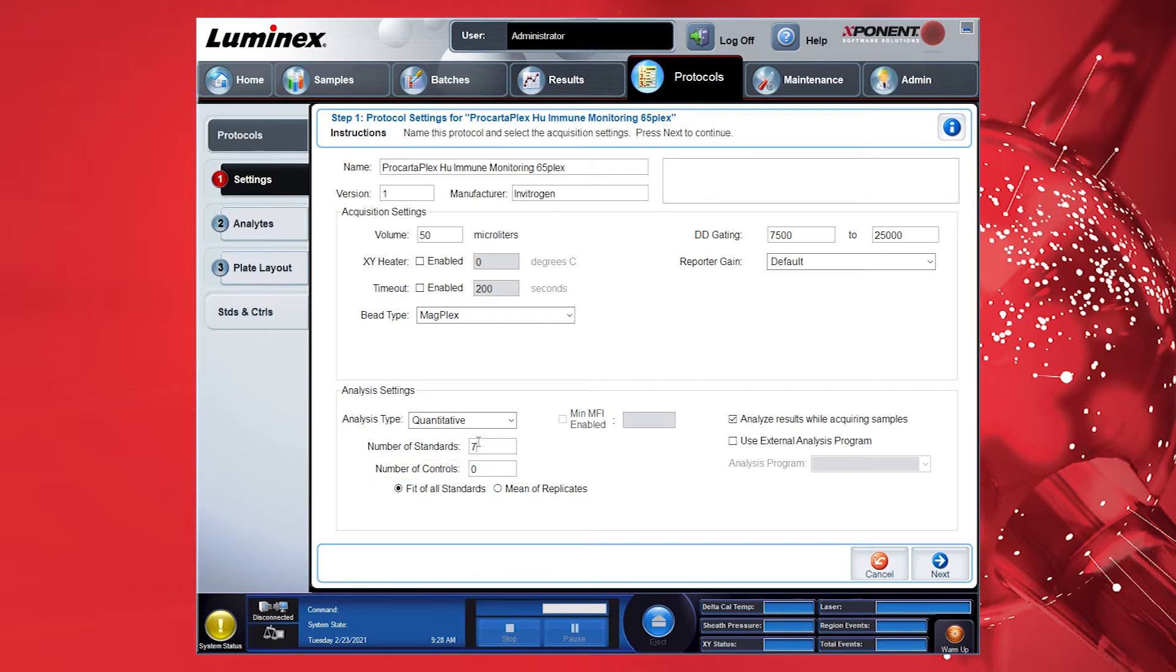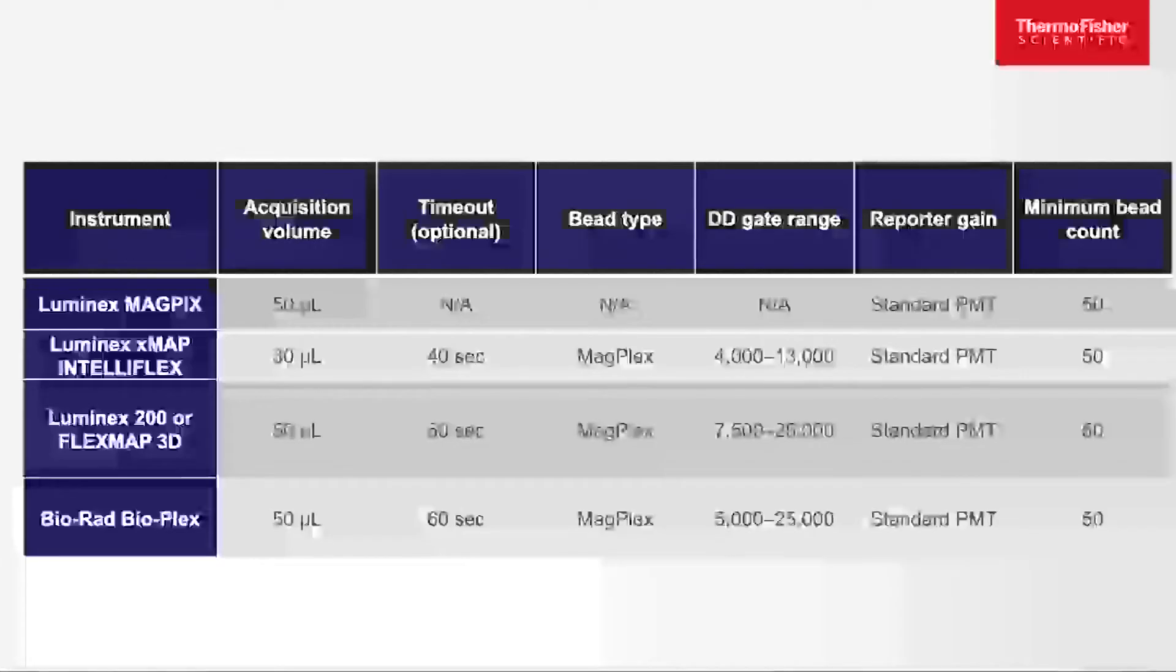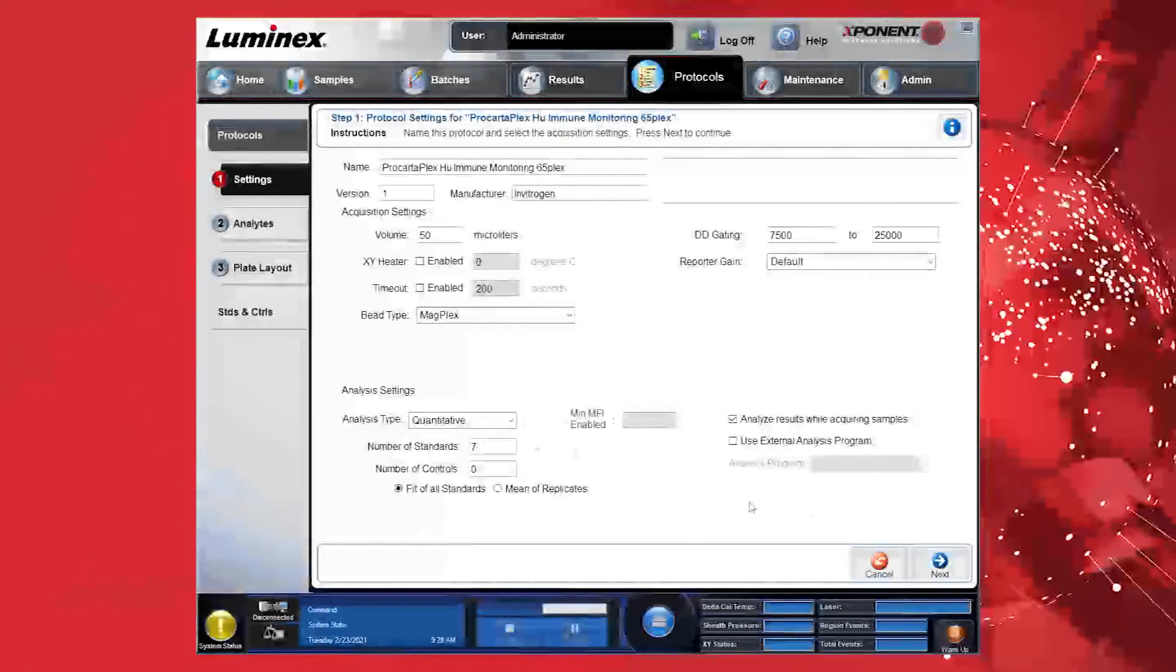Choose the Curve Fit, Fit for All Standard, as this uses a 5PL fit to calculate the results. Please refer to the table shown here for the recommended user settings for your instrument. Select Next.